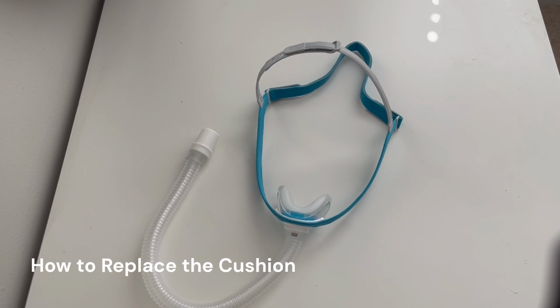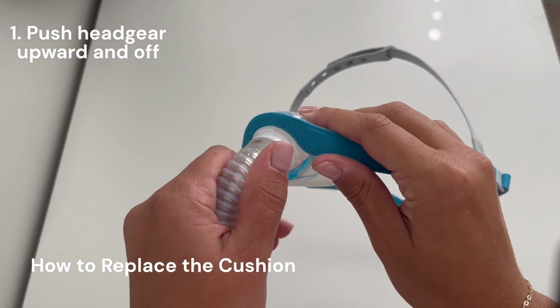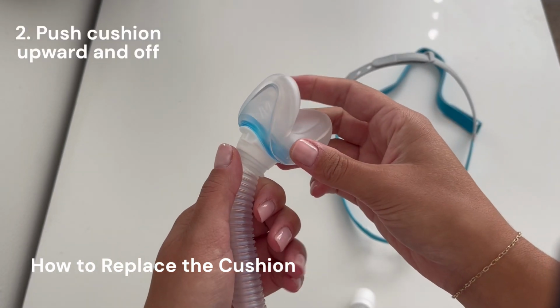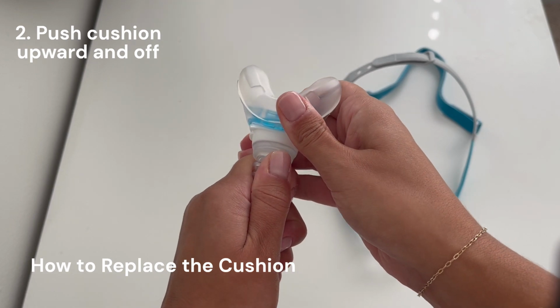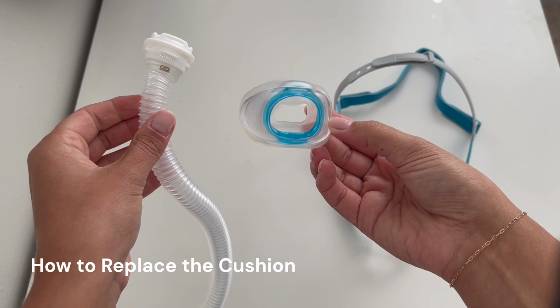To replace the cushion of this mask, start by simply pulling the headgear off. Turn the cushion and tubing around and use your thumb to gently push to disconnect them from each other.